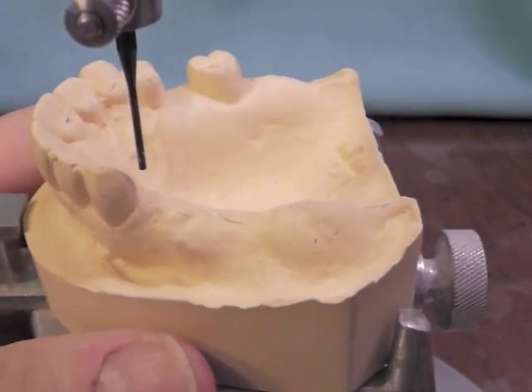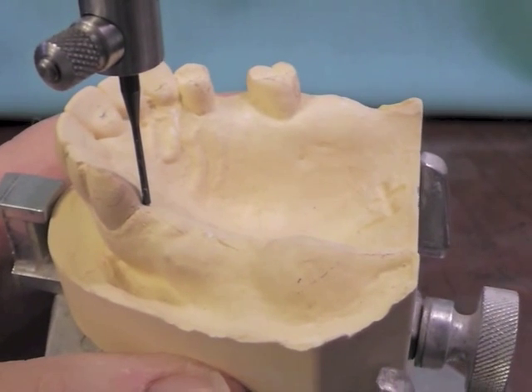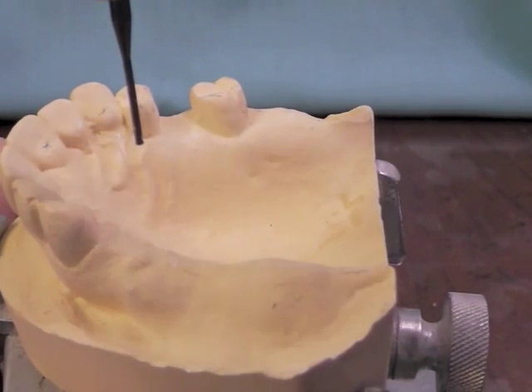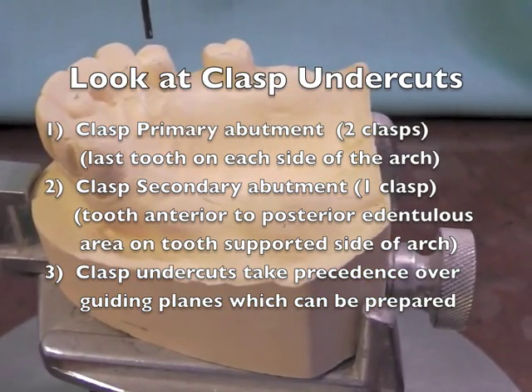I'll have to look at this tooth on the other side also, and again the survey line is right there down at the gingiva. So I think my parallelization is pretty good. Now I'm going to look at my desires for undercuts.